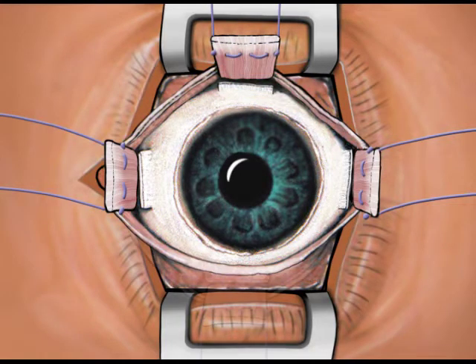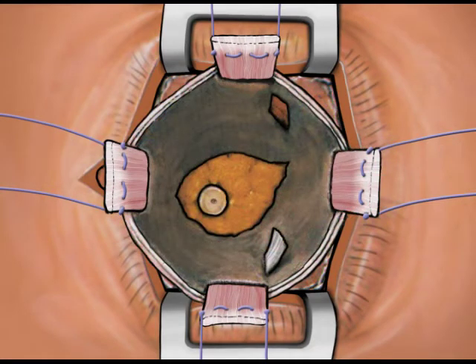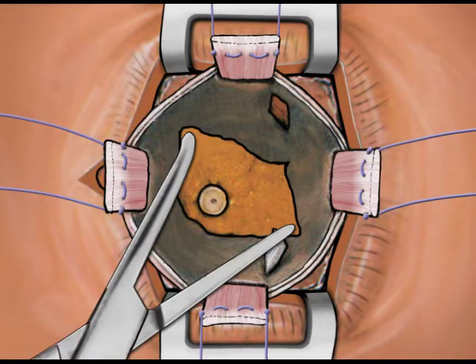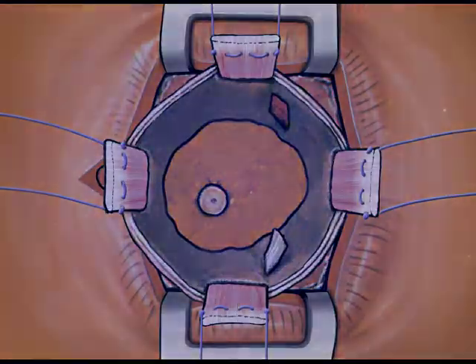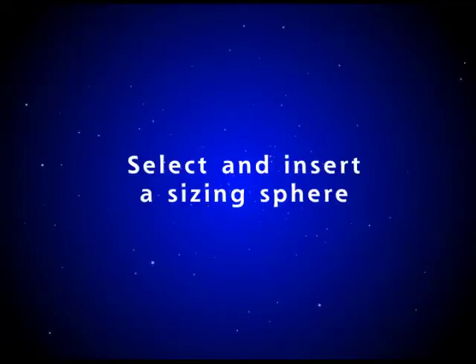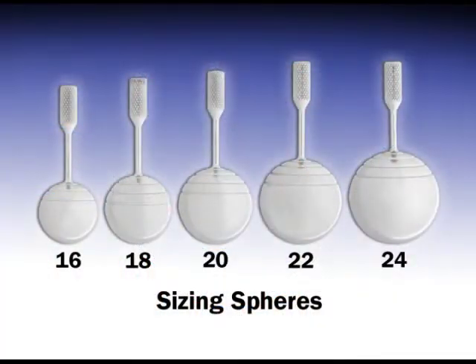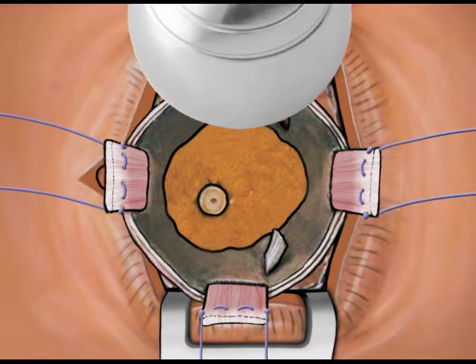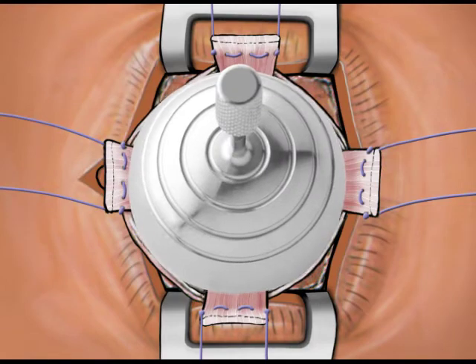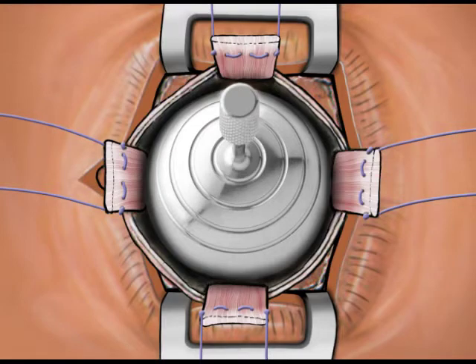Once complete, proceed to enucleate the eye. After the enucleation is completed, widen the opening in posterior Tenon's capsule by spreading with the hemostat. The socket is then sized with a sizing sphere to determine the proper size orbital implant. A sizing sphere larger than the chosen implant is placed into the socket to help maintain the space and to prevent swelling of the tissues of the socket.